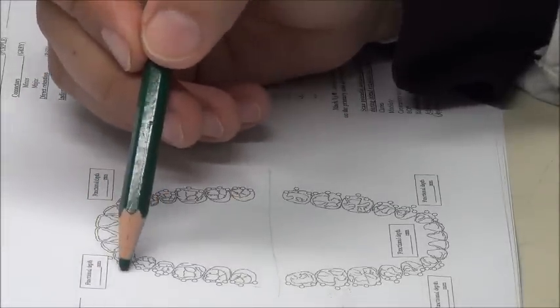Always take the functional depth. That's very important. What do we mean by functional depth? It's the distance between the marginal gingiva and the depth of the sulcus while in function. Not when the patient is resting. We put the muscles around in activity, and then measure what our measurement is.